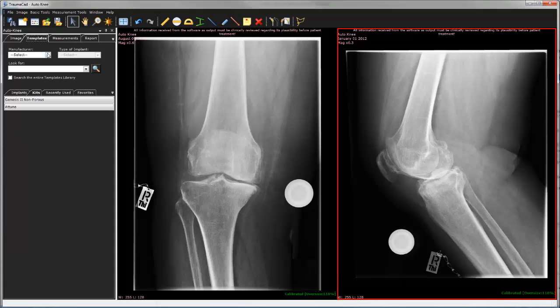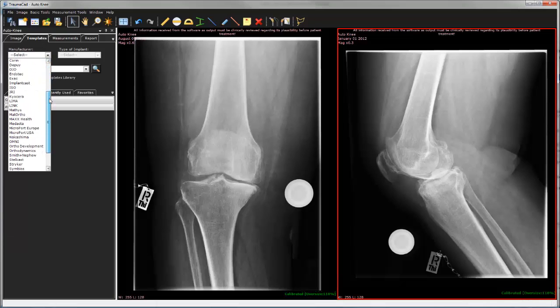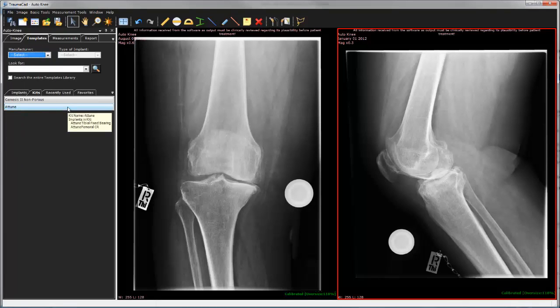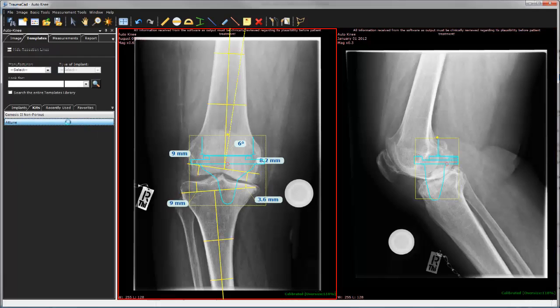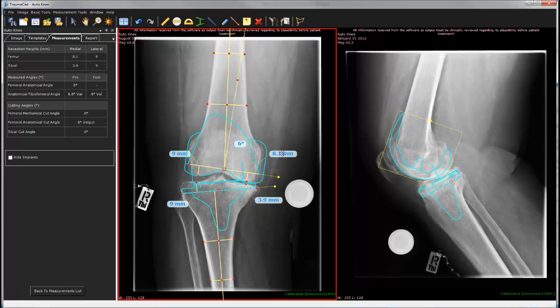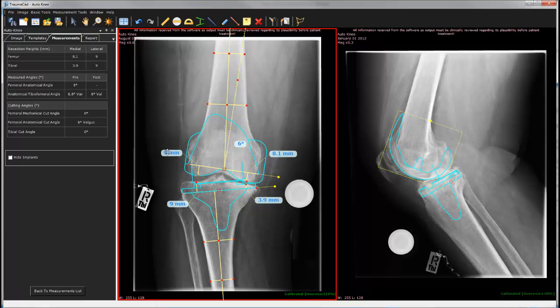In order to apply an implant to the image, select a template from the list of manufacturers or from your personal favorites or kits. Within one click, the application automatically detects the anatomical regions in the image, positions suggested resection lines, and determines the template position and sizing — the femoral component according to the lateral image and the tibial component based on the AP.